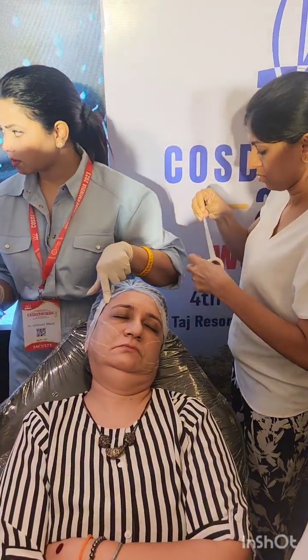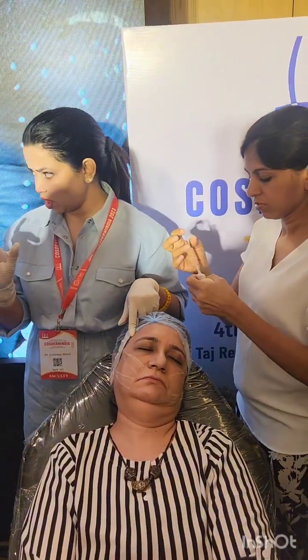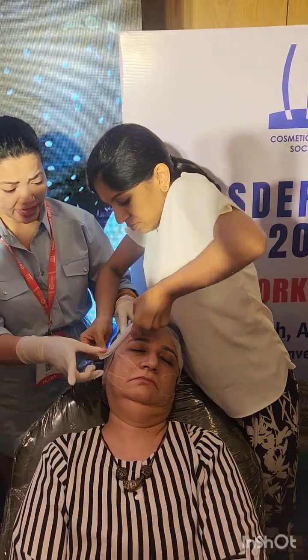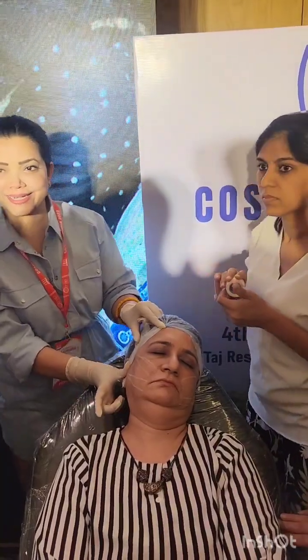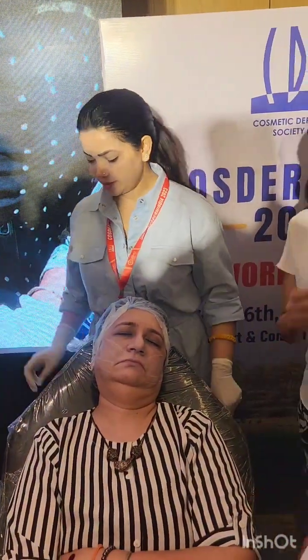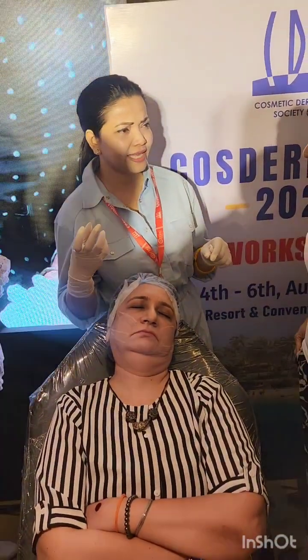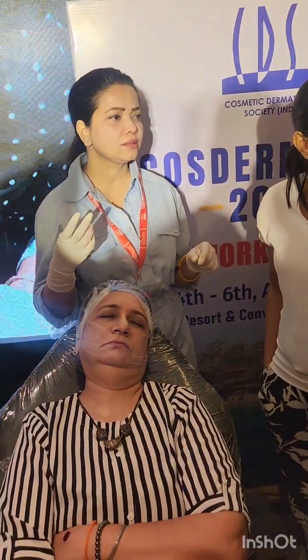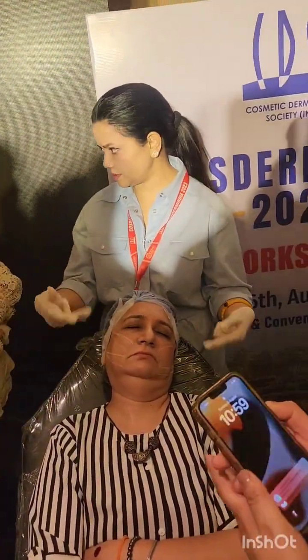For the cheeks and this eyebrow, you do the same thing. Same thread. The thread size is smaller. I'll show you marking for everything, but please remind me because I am very forgetful. So how much are you interested to learn? Just keep asking. The size of the scalp. Now what you do is, sorry, size of the scalp. No. It's 5 centimeters. Aditya, what is the length of the eyebrows one? 8 centimeters. And this is 10 to 12 centimeters.